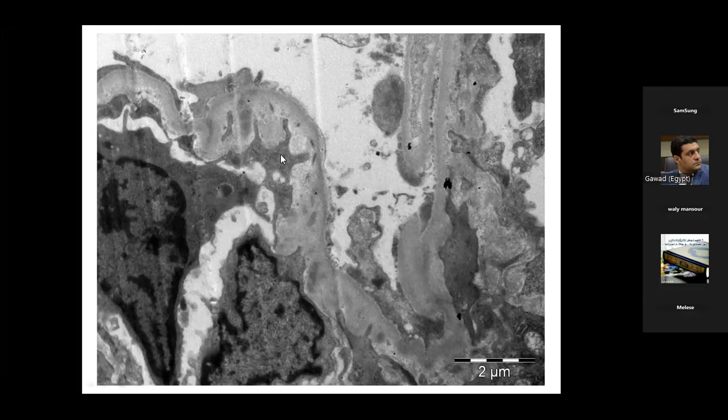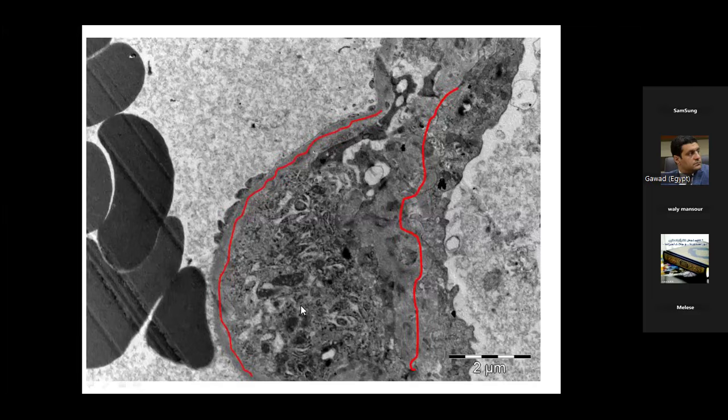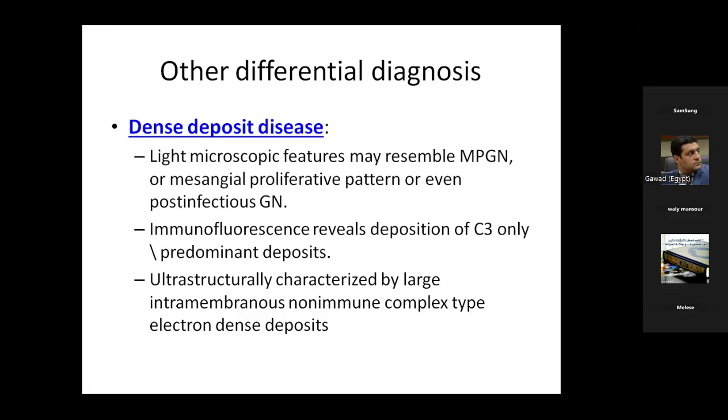This is an endothelial cytoplasm with arborization here in these defects that were formed secondary to the laid down immune complexes, with this interposition that will progress later on, and later on will be more and more till we have this double contouring that will be seen under light and electron microscope.